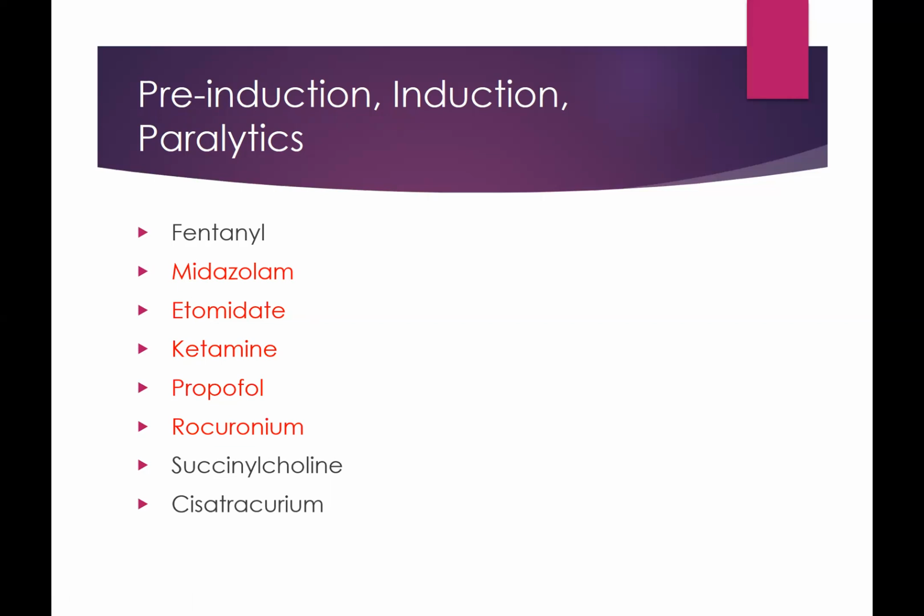Sometimes people ask me, why do we paralyze folks when we intubate them? And the primary response is, we are really going to be passing an endotracheal tube down past a couple of reflexes and part of the upper airway. What I don't want to happen is for the airway to spasm around the endotracheal tube as I'm trying to pass it. And if we can eliminate the gag reflex and the cough reflex, maybe we can eliminate some of the complications that occur with the intubation process.